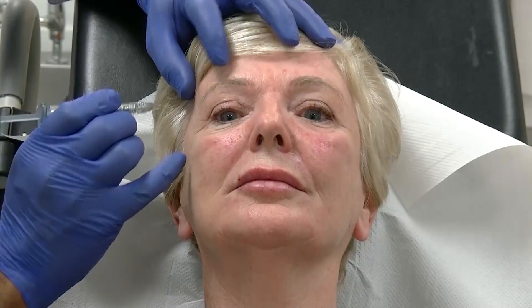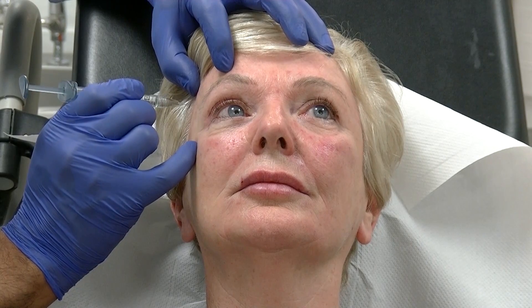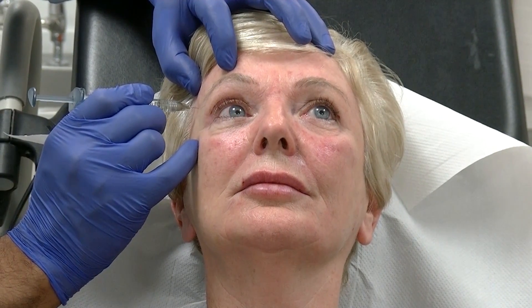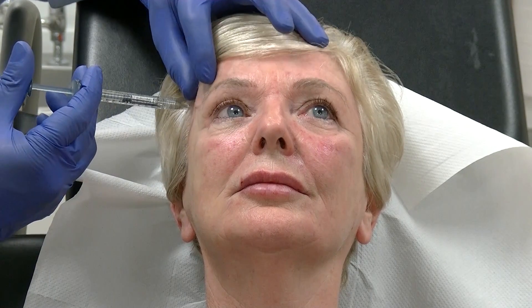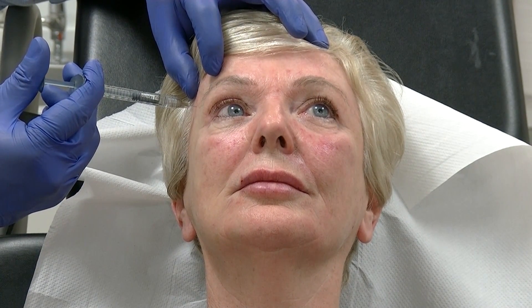We'll work our way down — a sharp scratch coming up through the skin, through the deep temporal fascia, through the muscle, onto the bone. Aspirate, elevate, and give half a mil injection.